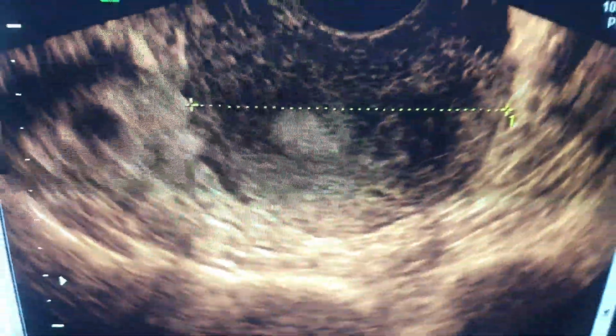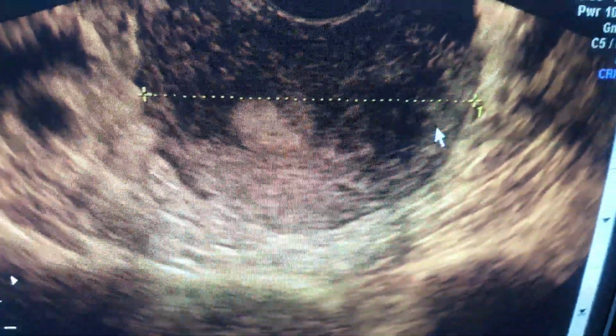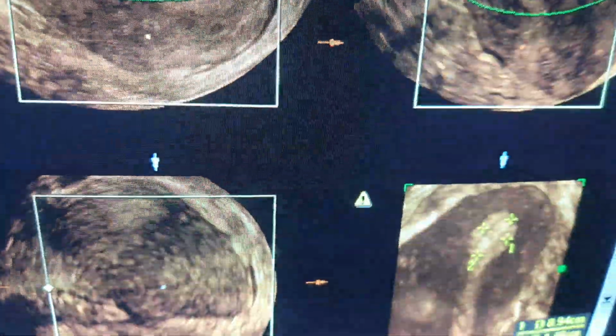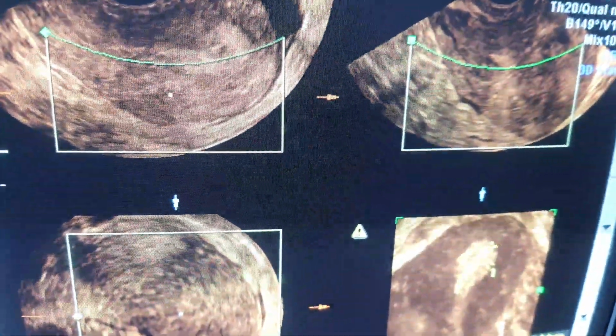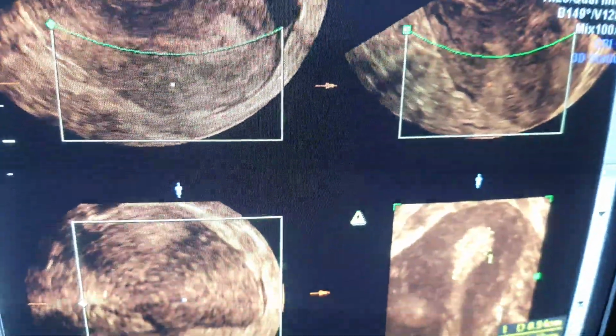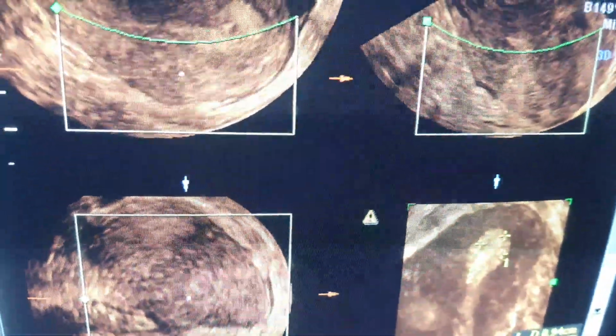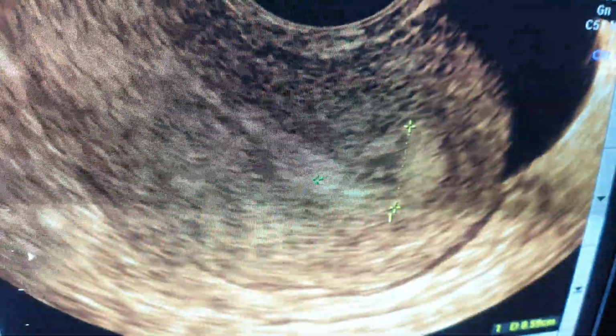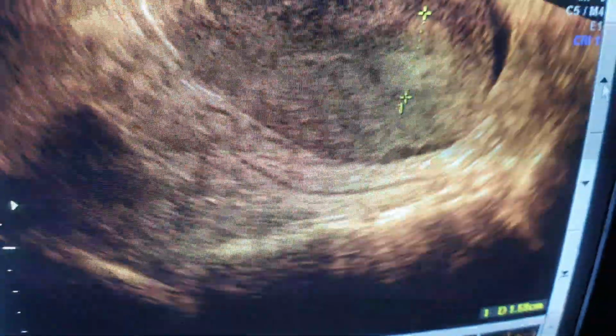And when you continue the diagnosis, you may have a transverse section of the uterus, as you can see here, and this is the endometrium, and this is something abnormal in this picture. I want to show you in the 3D orthogonal plane how we can work on this plane, okay? Of course, you save the 3D ultrasound, and you can work on the 3D later.